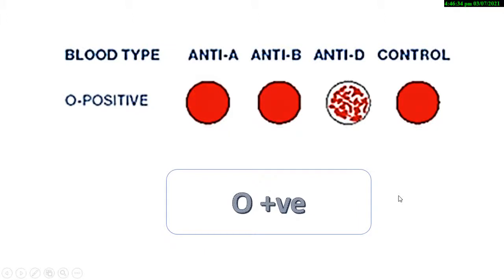After one to two minutes we can read the results. There is no agglutination on slides A and B. We can now see agglutination on anti-serum D. Since there is only agglutination on anti-D, the blood group is O positive. Thank you dear learners for watching the video.